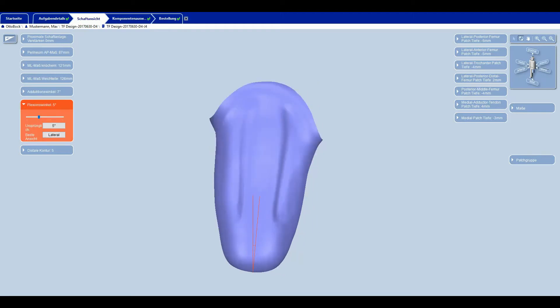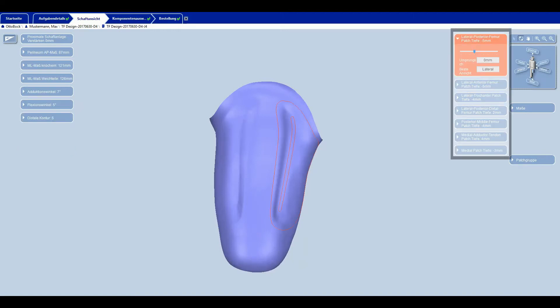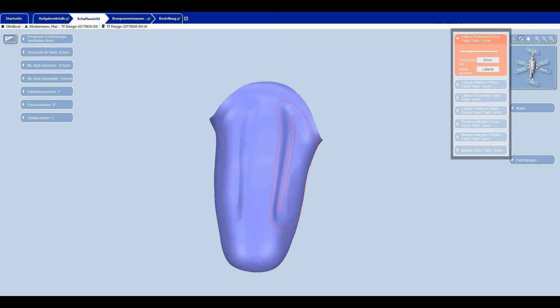There are eight patches available for custom adapting the prosthetic socket to the residual limb conditions. The patches are only visible in the software if they are useful from a biomechanical and functional perspective. The maximum adjustment strength of the patches is between 6 and 8 millimeters. Using patches thereby influences the socket volume.